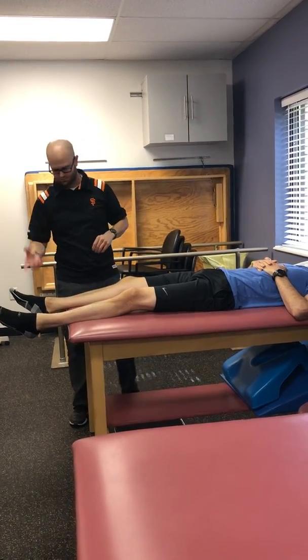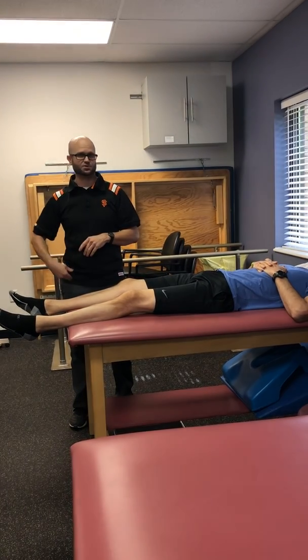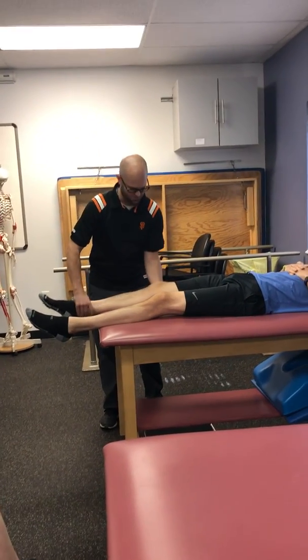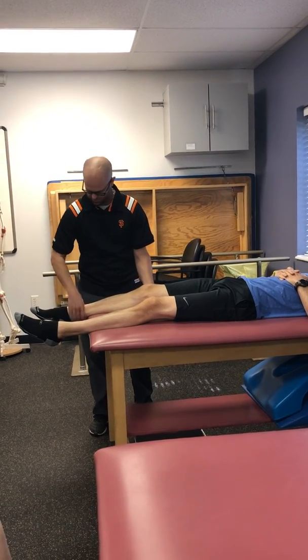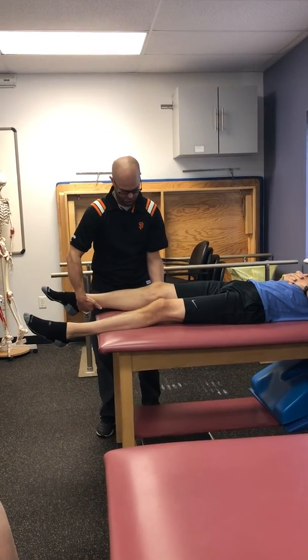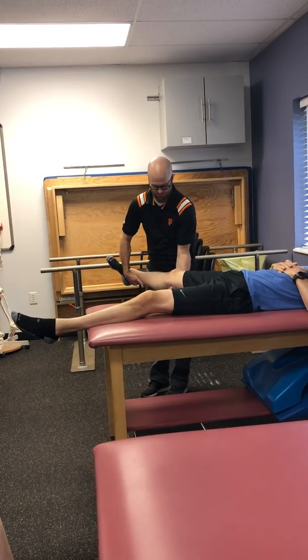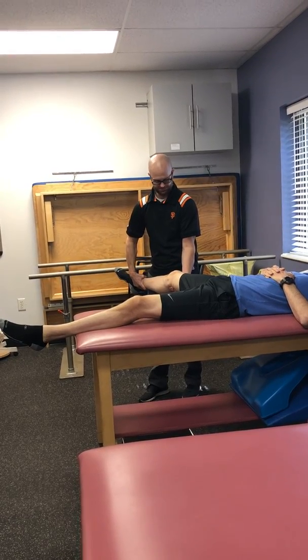okay? And it's really big when we're worrying about active range of motion, because we don't want those hip flexors to come into play, okay? So I'm going to try and keep him so that his knee, his patella, is straight up and down, and same with his toes. So I'm going to actually internally rotate him, or go against him. He's still stretchy. Okay, right there.